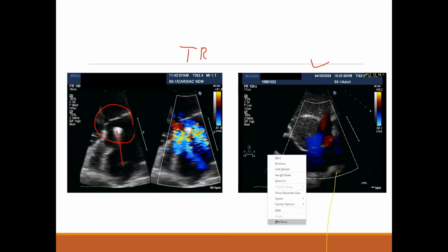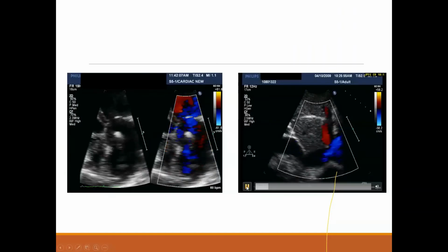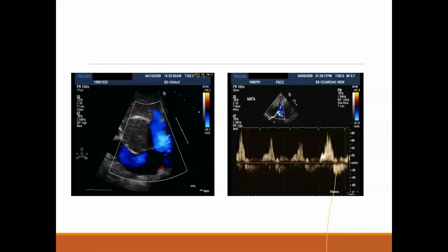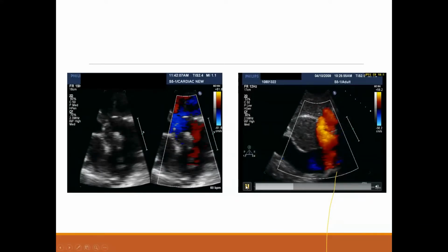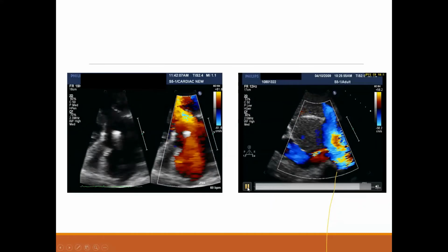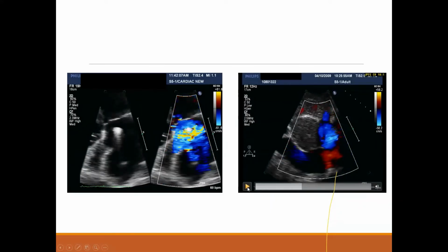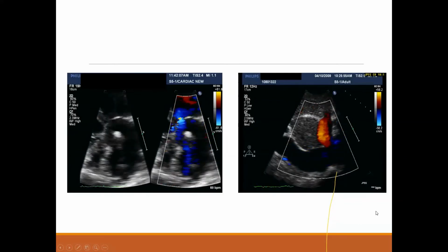Yes, dilated IVC, but there is no... If I stop it here, look here. No. This is blue color, right? Blue? Okay, now let me see. I wish I'm going to catch it now. Oh, not yet. Okay. Now you look here.